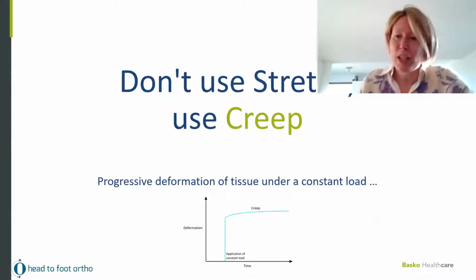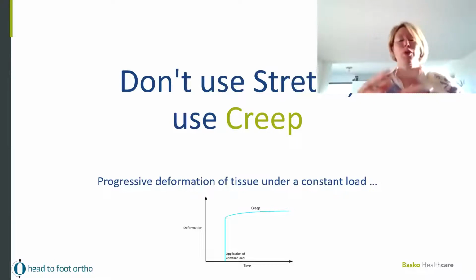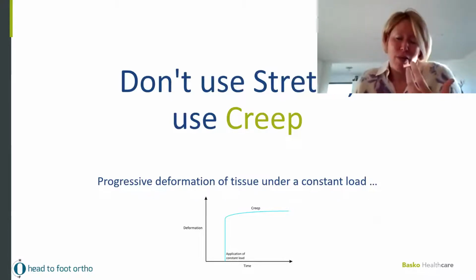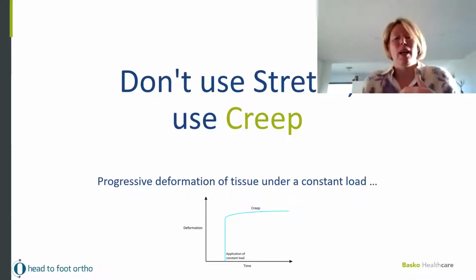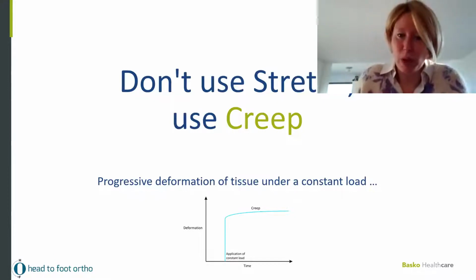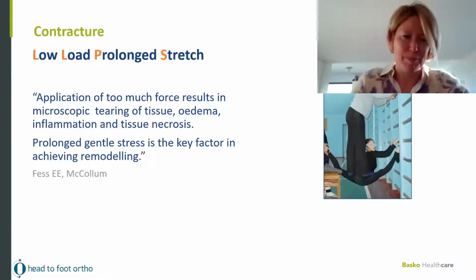During this presentation, I use a lot of the word stretch. We're going to stretch, we're going to apply the lengthening force. Just for your information, eventually what we are doing is applying an almost constant load. Technically, we should use the word creep instead of stretching. So what we're going to do is creep the tissue instead of stretching.